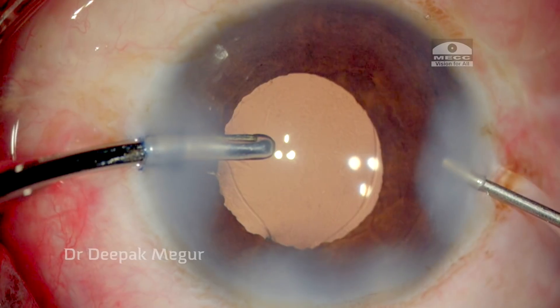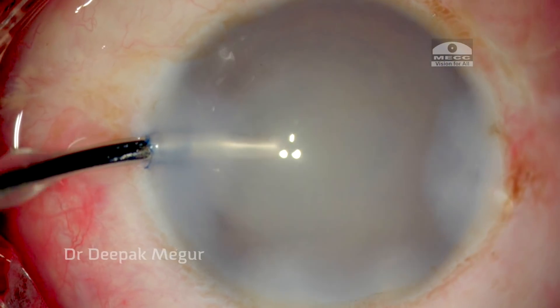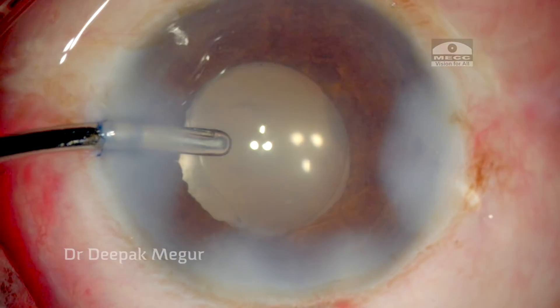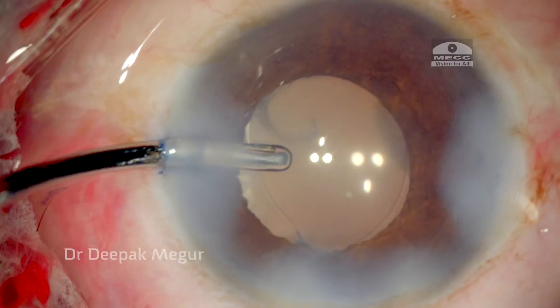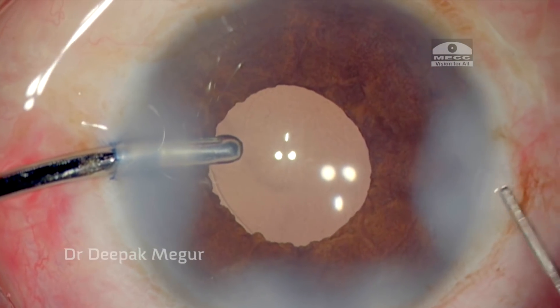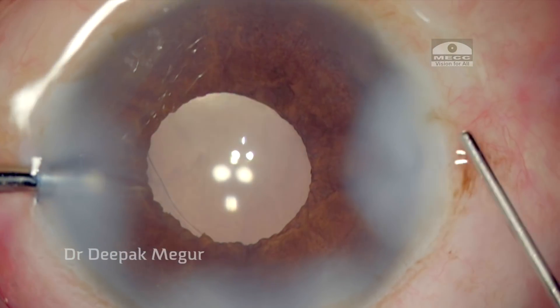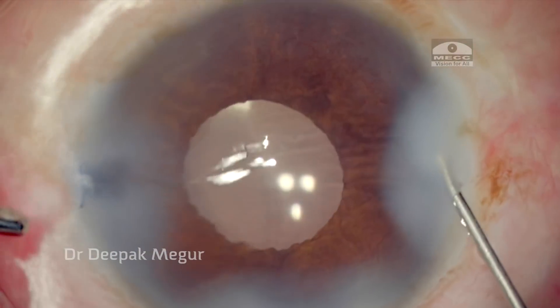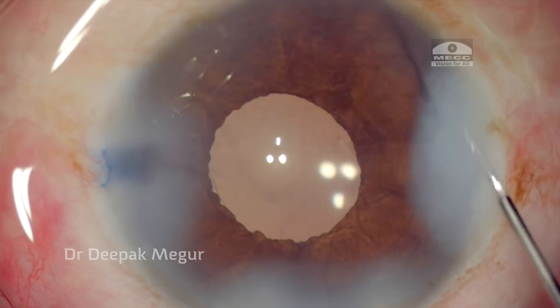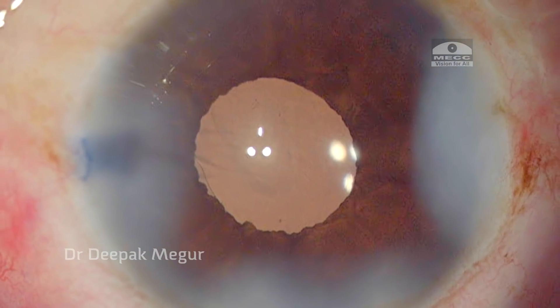I inject pilocarpine to constrict the pupil, and then a little triamcinolone acetonide to ensure there has been no prolapse of vitreous — luckily there has been none. Before removing the irrigating handpiece, I hydrate the wounds so that there is no shallowing of the anterior chamber. Once hydration is completed, the case looks good.